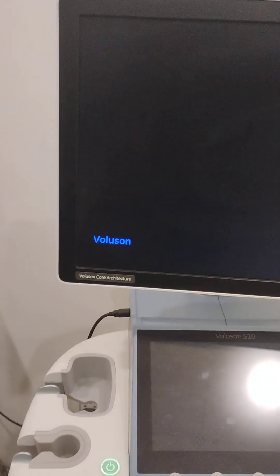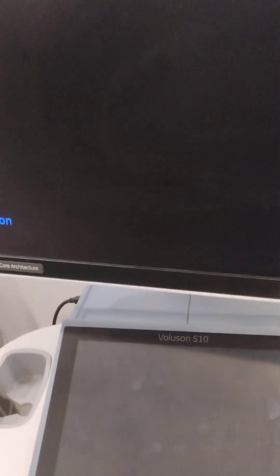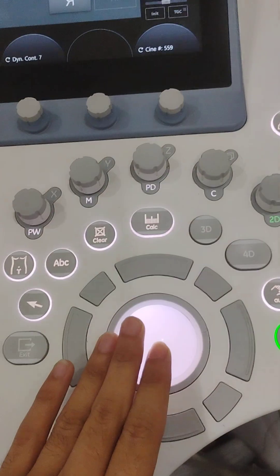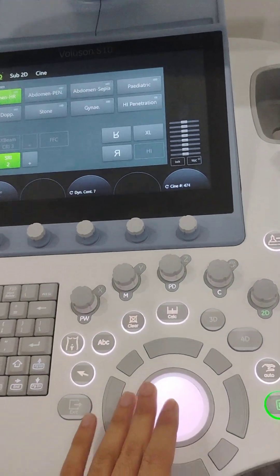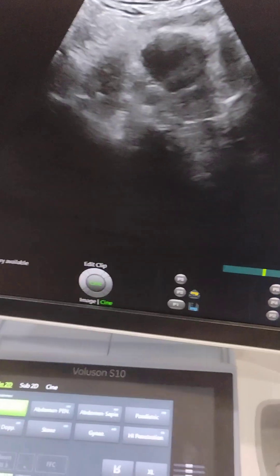This is from Verluson General Electric, and the model name is Verluson Series S10 — here you can see Verluson S10. This is the ball, which is the cursor, like there is in a computer. With the help of this cursor you move around on the display.